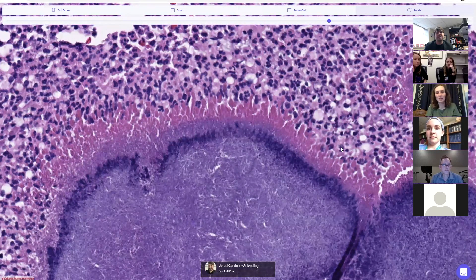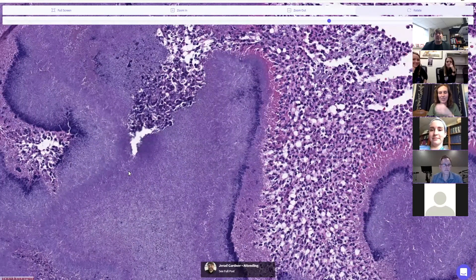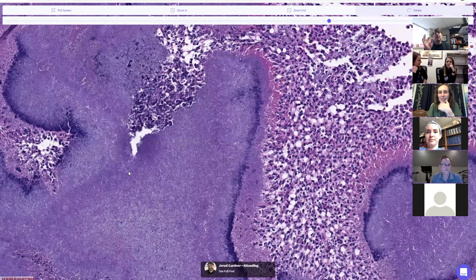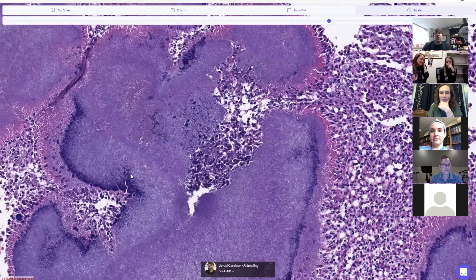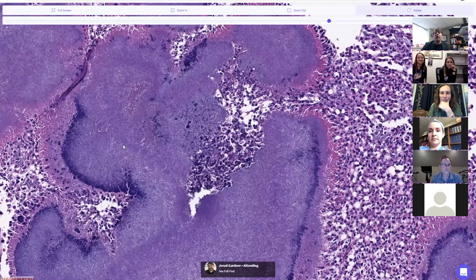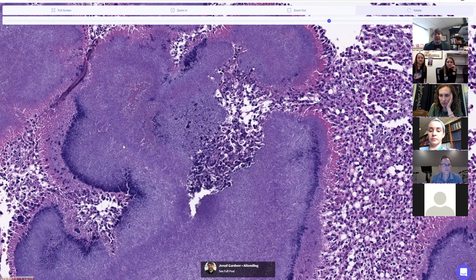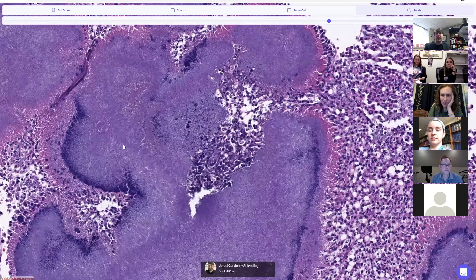It can be hard to sort out unless you know the location, have culture results, or can do additional stains. The main differential is between actinomyces — called actinomycotic mycetomas — and fungal organisms, which are called eumycotic mycetomas, meaning true fungal. So mycetoma can be either actinomyces or true fungus.